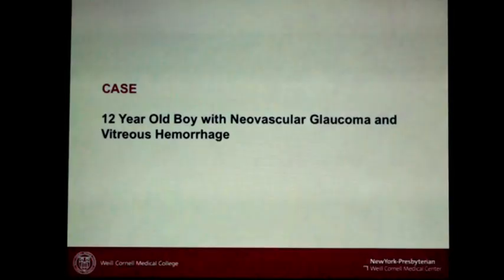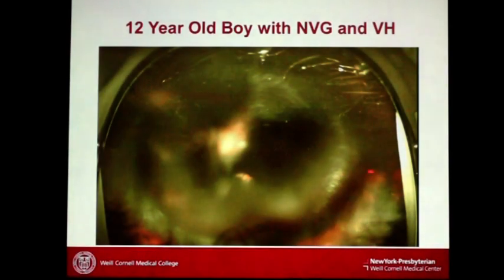Here's another patient, a 12-year-old boy with neovascular glaucoma. Now, in terms of surgical planning and surgical assessment, I think this is very critical to get my imaging, preoperative and postoperatively. Here's this child, vitreous hemorrhage. Now, the nice thing, and this is what Dr. Wall mentioned, it's not really a camera, right? It's a scanning laser. So it can oftentimes get through media opacity in a way that a regular fundus camera cannot. Okay, so here's the hemorrhage.